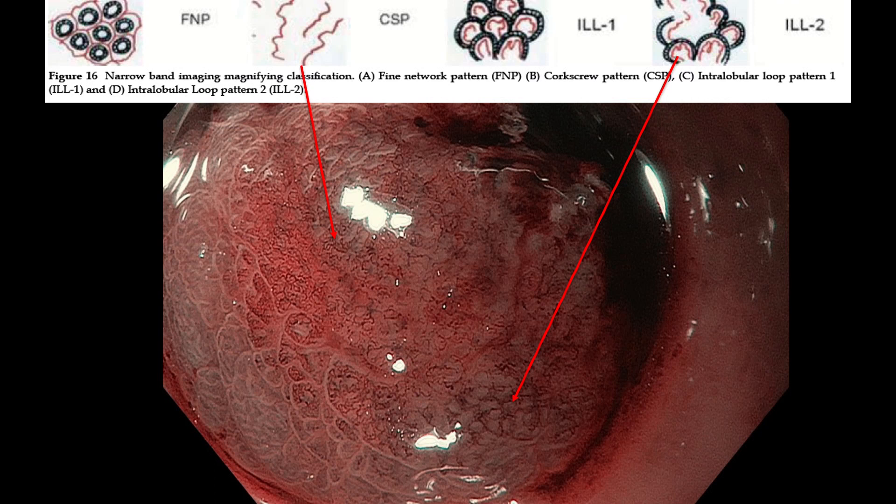But in the case of poorly differentiated adenocarcinoma, we keep a wider safety margin. I usually put the marking dot five millimeters away from the target region, then cut outside the marking area. That means we can keep nearly eight millimeters of safety margin for poorly differentiated adenocarcinoma.